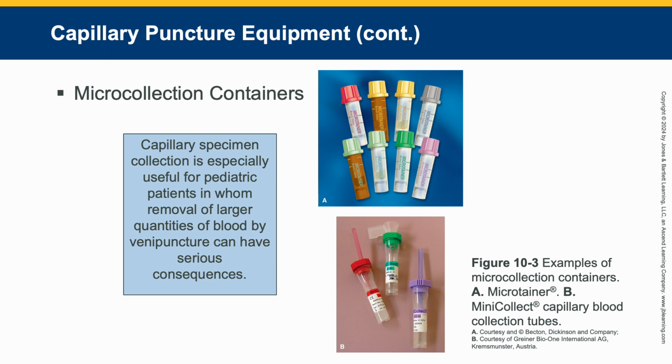There's going to be lots of problems if you don't label that. But also just don't do it unless the actual manufacturer states that it can be done. And again, you can't take it from another big tube and pour it into the little tube, because then you have already messed up how much of the anticoagulant that is in the big tube. You're pouring it in a little tube and all of the percentages are off now. Okay, so let's move along.